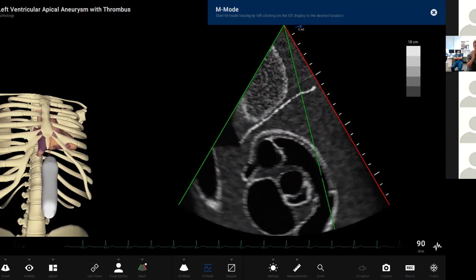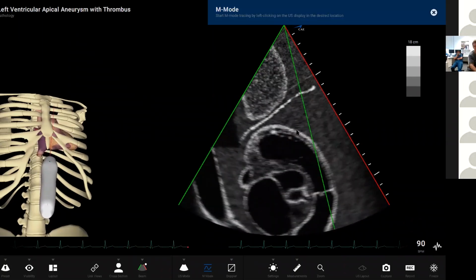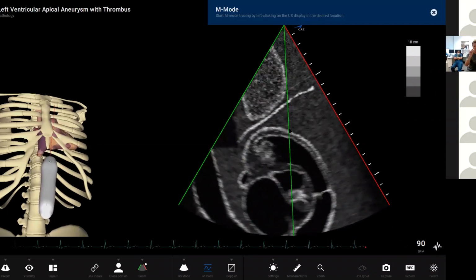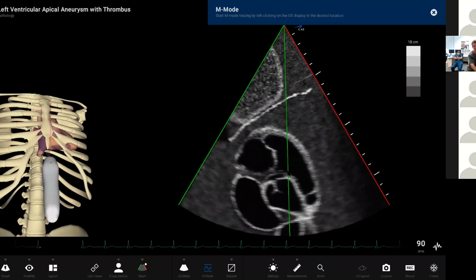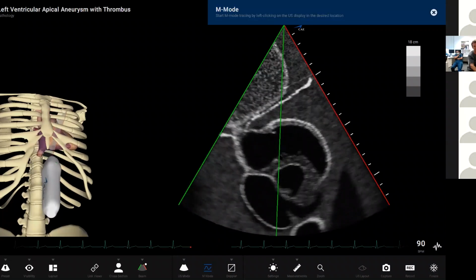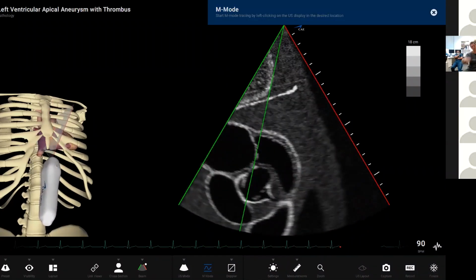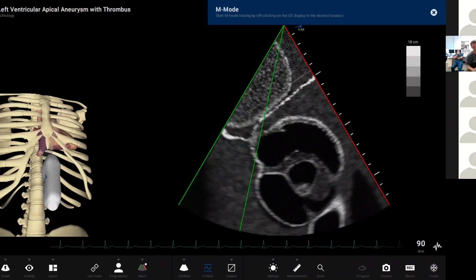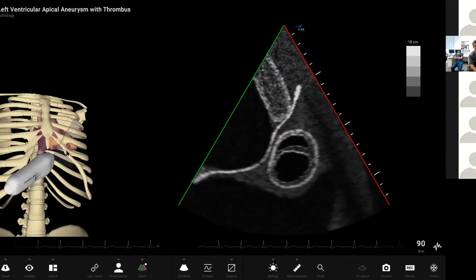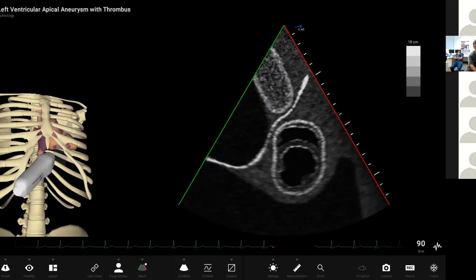So if someone is difficult to view for pulmonary hypertension, we can use this. In the subcostal view we also get a nice place to get axial resolution to measure our RV free wall. It's not perfect, but you can also get your tricuspid valve in there, with a little bit of rotation, and maybe an off-axis view for your tricuspid regurgitation if it's quite eccentric. Again, you've got that short axis view that you can fan down all the way from apex to base from a subcostal view.